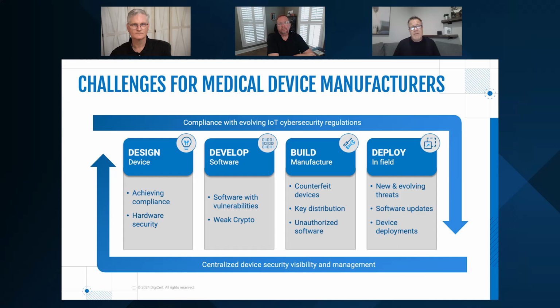And so they need to protect themselves against that. And some of these IoMT companies are manufacturing in Southeast Asia. So maybe the firmware is being written in Germany, the device is being manufactured in, let's say, Taiwan. And so the whole supply chain and ensuring that the devices are legitimate, not counterfeit, getting keys and certs onto those devices at a third party manufacturer is really important.